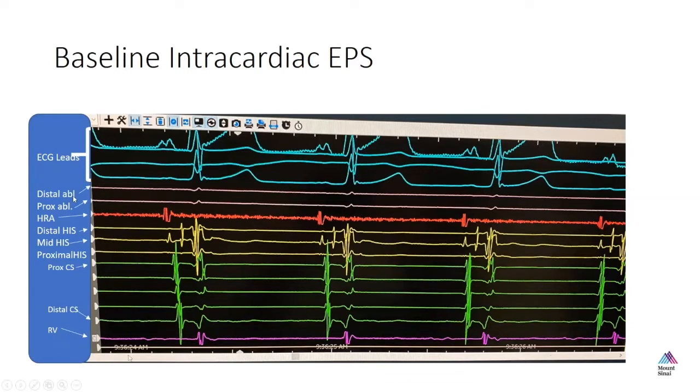So we have 4 leads, and then typically in our lab, we display the distal ablation and the proximal ablation. And it's important to remember that the order in which I'm demonstrating these leads and in which we do it here is different in every lab.